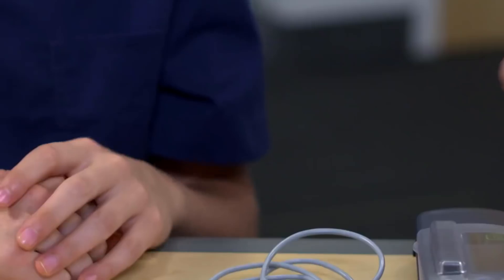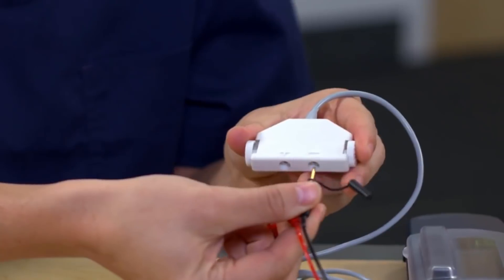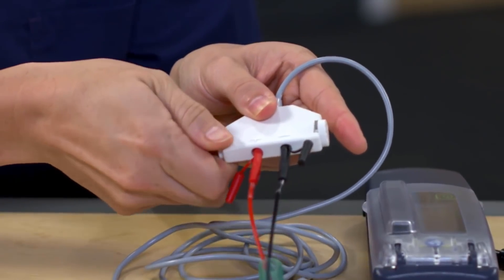So go ahead and place the lead. I'll match the negative lead portion to the negative cable port and do the same for the positive portion. And then you can use your fingers to tighten them by turning the thumb wheels until they're snug.